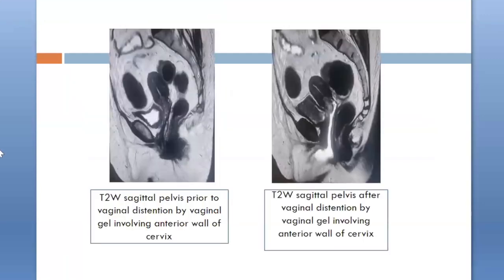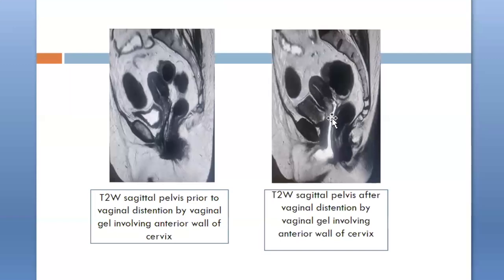This is a T2-weighted sagittal image of MRI pelvis. Here we can see a T2 hyperintense lesion involving the anterior wall of cervix. The second image is obtained after distension of the vagina by vaginal gel. Here we can appreciate the lesion better, which appeared hyperintense on T2-weighted image in the anterior wall of cervix.